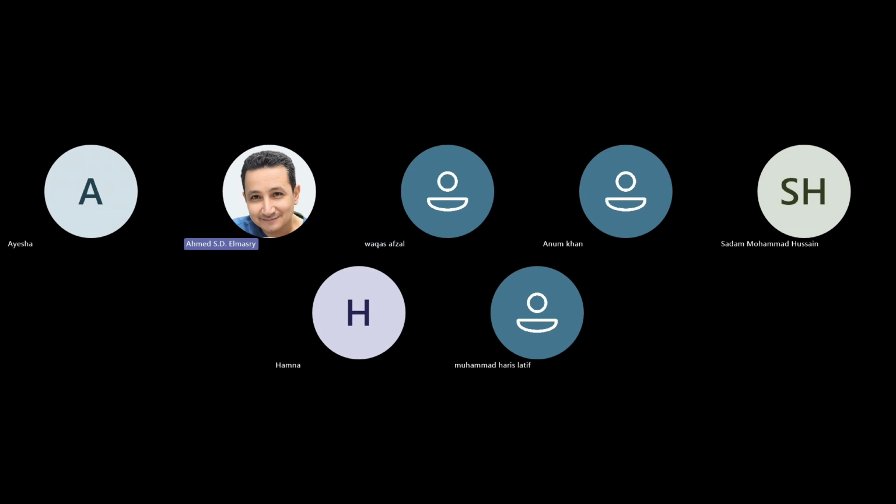But the problem is, once you stop the balloon, the patient's hemodynamics might deteriorate if the patient is still dependent on the intra-aortic balloon. So the priority is to optimize the hemodynamics and to commence vasopressors and inotropes according to the clinical situation. And if the patient is not stable, you can remove the intra-aortic balloon and introduce a new one.